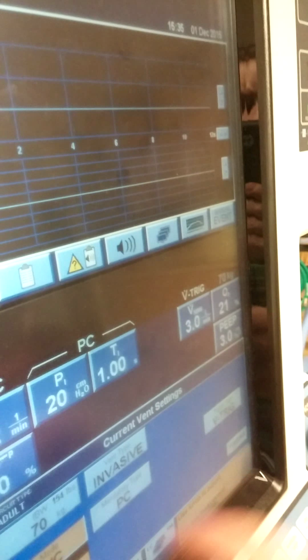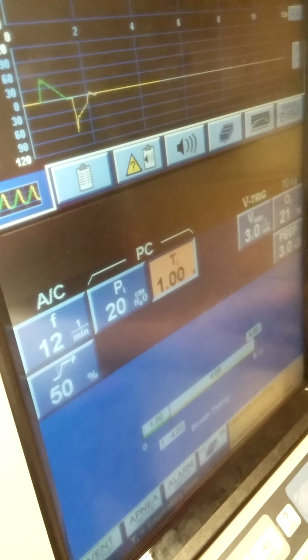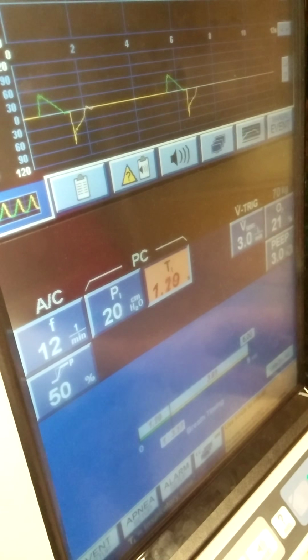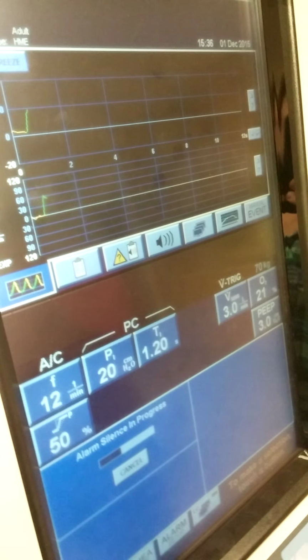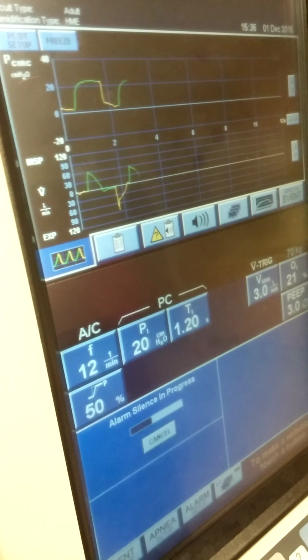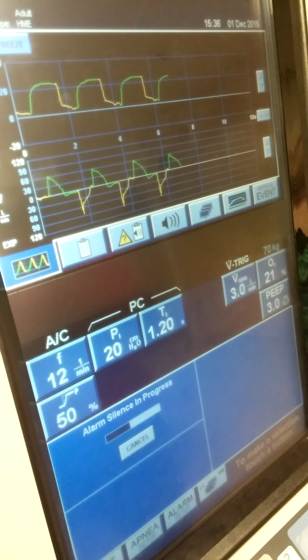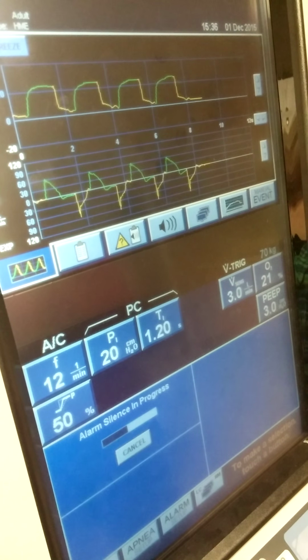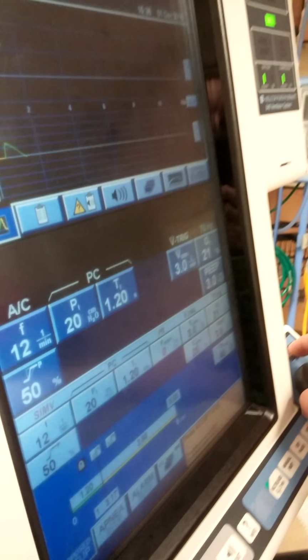If I go back and I make them now into SIMV, and let me make my top inspiratory time a little bit longer, what they have the availability of doing is now breathing spontaneously at both levels of pressure. Right? But the volumes aren't measured. I'm still in assist control, aren't I? Yeah, hang on. If you hit accept, it might be a good idea.